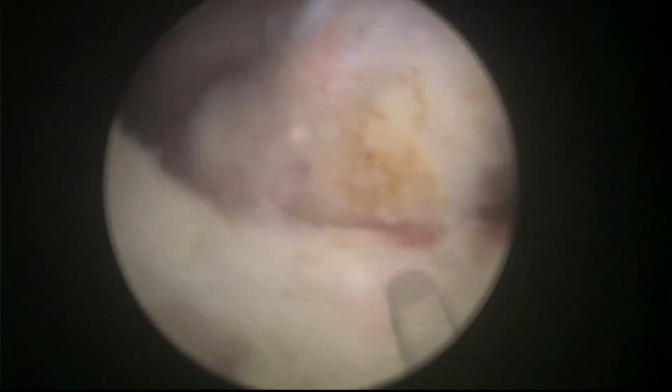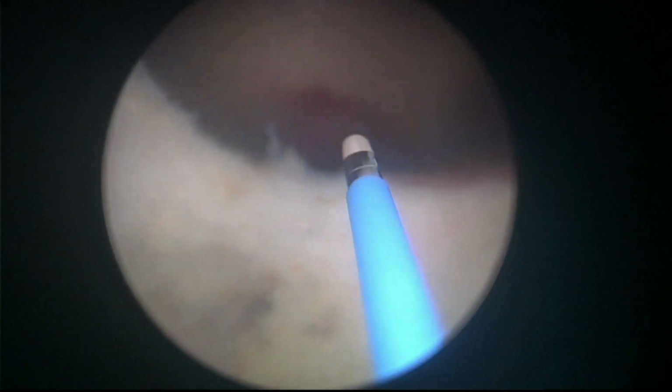And that's almost the end. You can see that we have a nice fossa, good hemostasis. There's some minimal attachment, but now the case is finished.